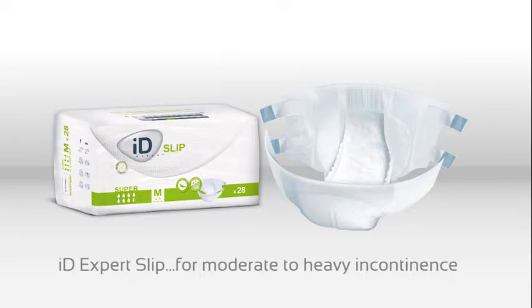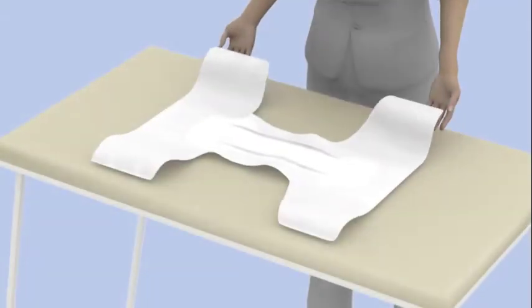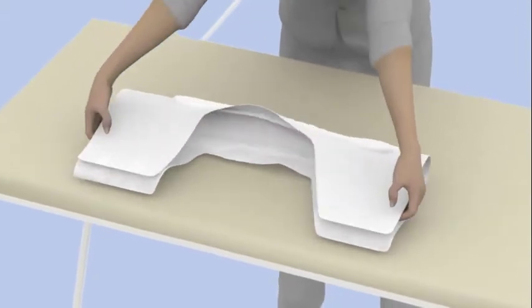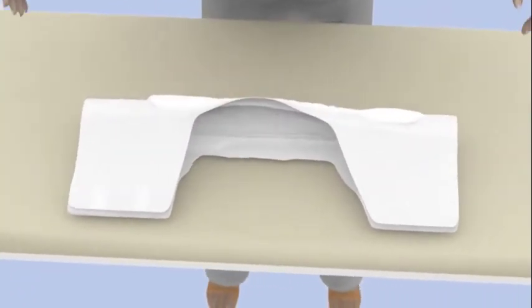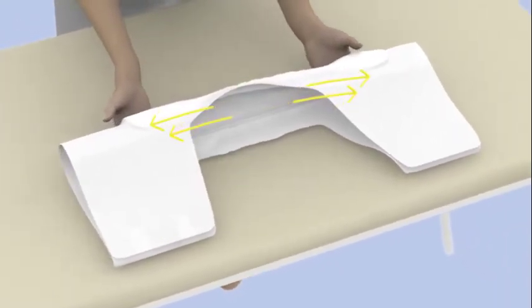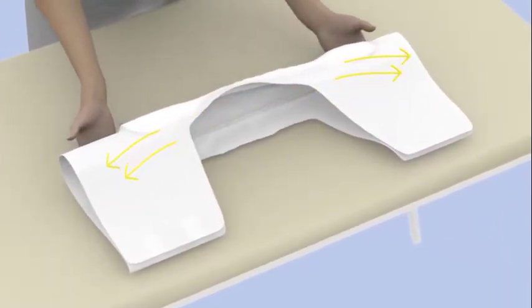To ensure the comfort and security of the patient, it's important that this product is fitted correctly. Start by folding the IDExpert SLIP in half lengthways and gently channel it by running your fingers underneath the back sheet, pulling from each end to stretch the pad. This activates the anti-leak cuffs.